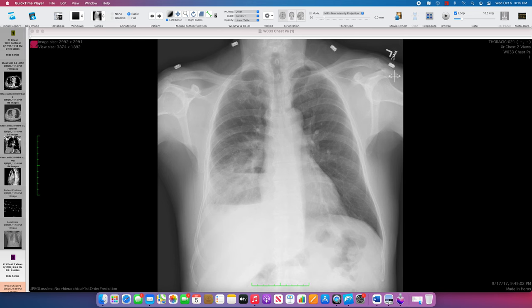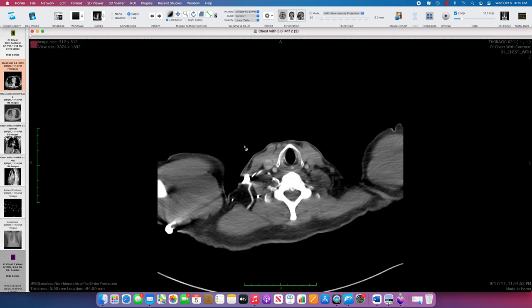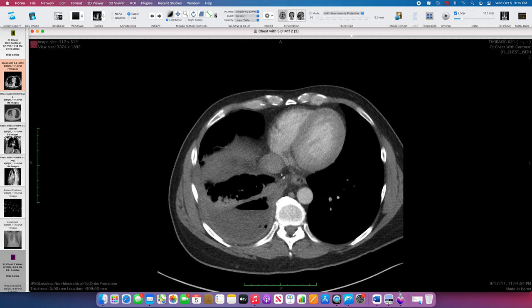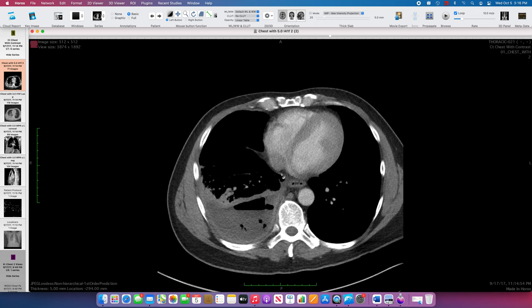A CT chest is ordered, and generally you will be giving contrast in that setting. As we scroll down into the area of concern, there's something called the split pleura sign. Outside of this, there is a thick pleural rind, and anterior to it as well — surrounding this whole thing there is this enhancing pleura, and that's a characteristic finding of empyema.